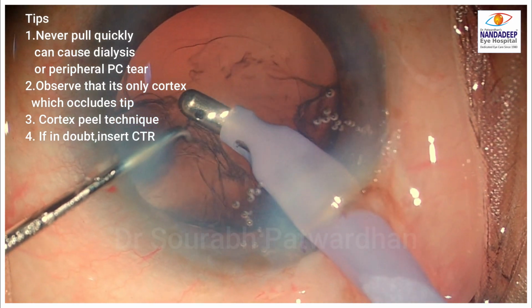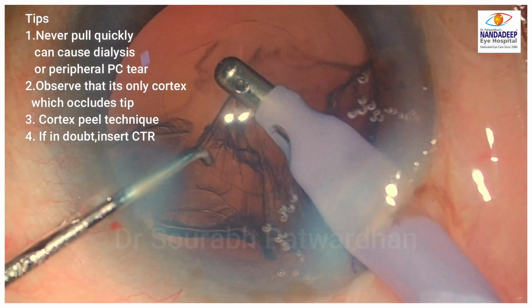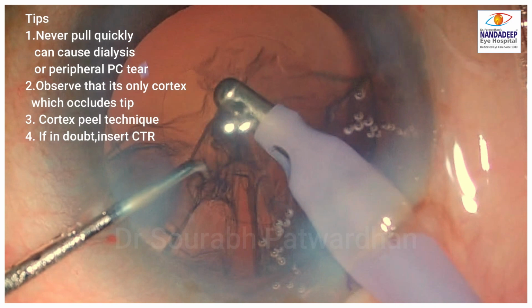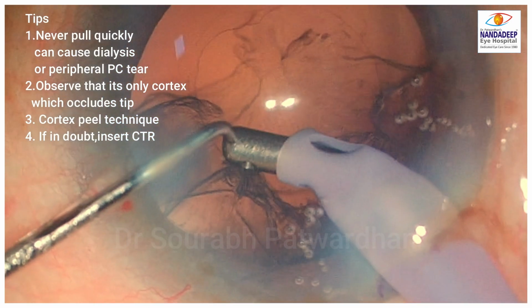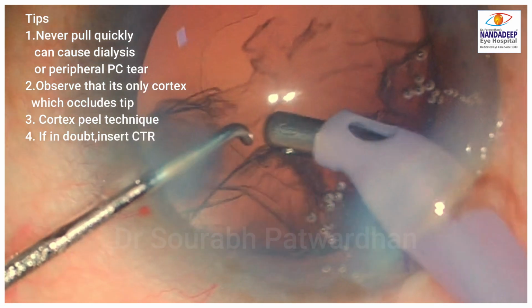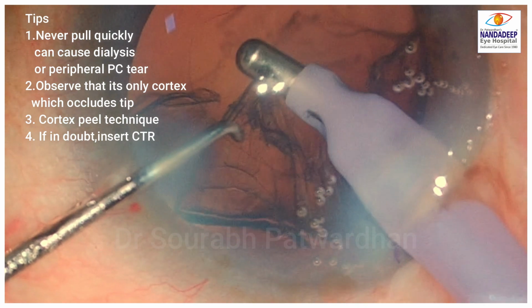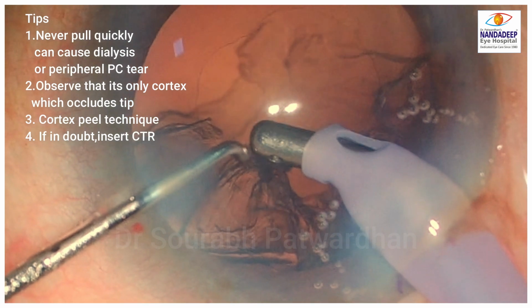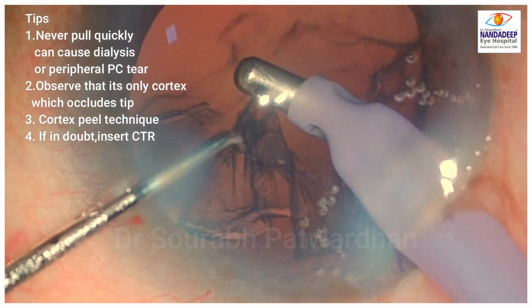In the area where the posterior zonules are weak, always be careful, as if you pull quickly it can cause frank zonular dialysis or can result in a peripheral posterior capsular tear. So observe that only the cortex is occluding the tip and use the cortex peel technique where you gradually try to release the cortex from the posterior capsule.